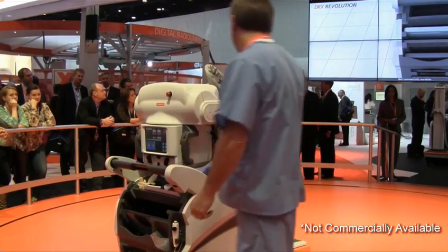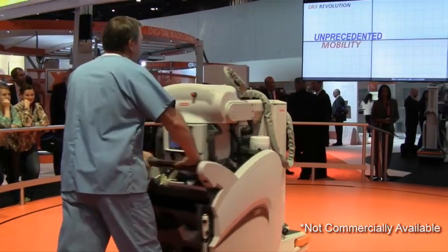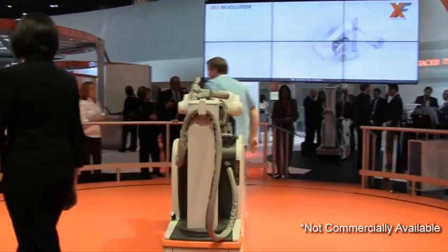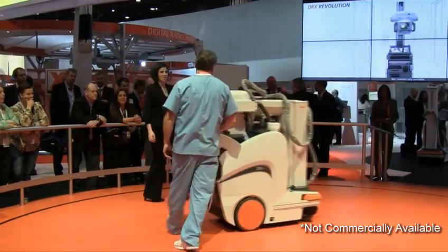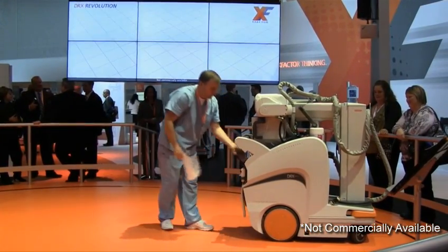With generous storage for gloves, sanitizer, markers, whatever you'll need. The revolution will be a four-drive system aimed at delivering unequaled maneuverability. A unique collapsible column provides a wide open view, so making your rounds should be smoother and safer than ever before.